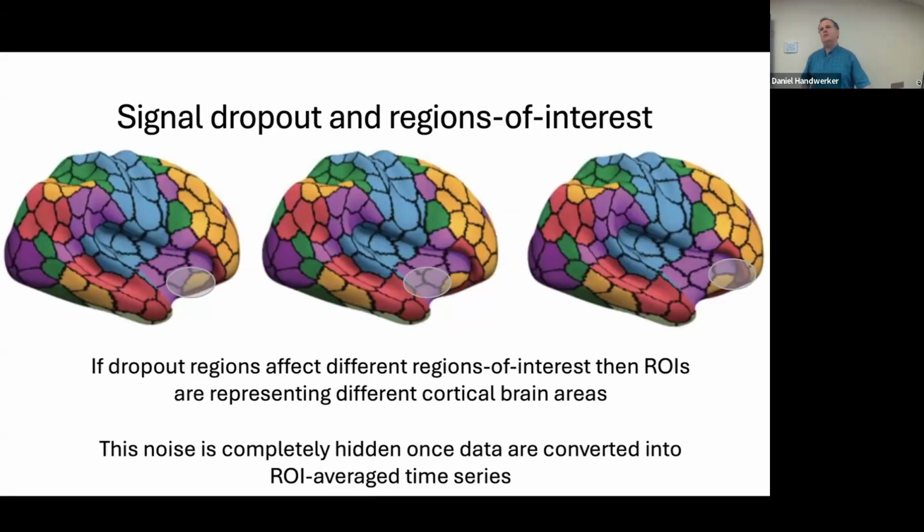Yes? So you have a proper structural image, most likely T2 or T1 image. And you do some form of EPI distortion correction that may help with this, or do you just discard the data? So you can definitely do distortion correction. There are two different problems: distortion and dropout. There are some really bad distortions that you can correct, and we definitely have methods that reduce distortion. But dropout is essentially your signal, because of various artifacts, decreasing so fast that you just don't have signal. So if you don't have signal, there's nothing to bring it back.